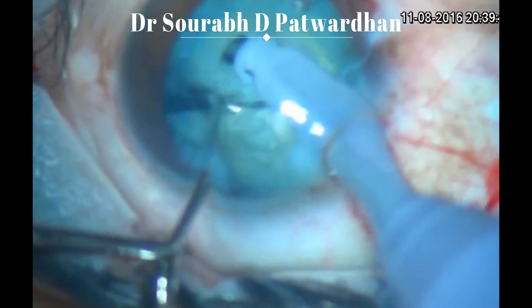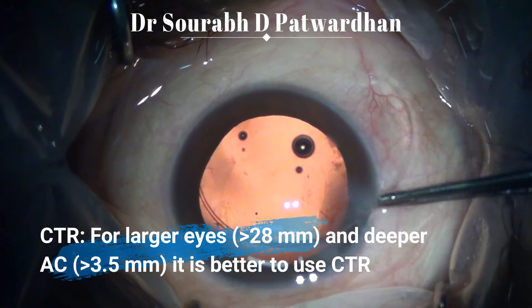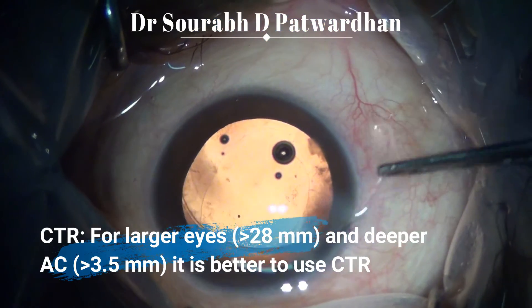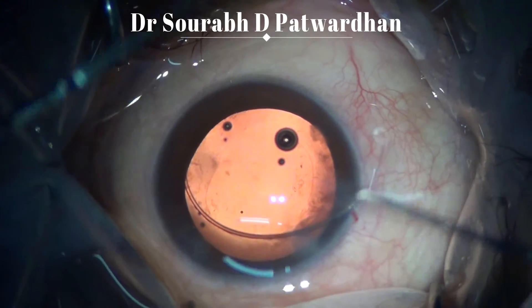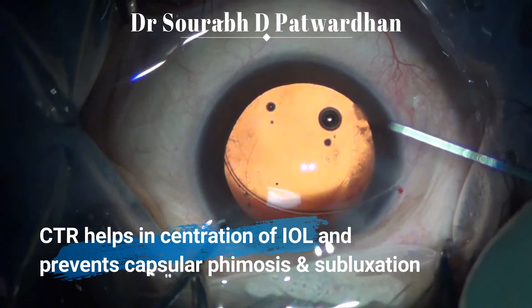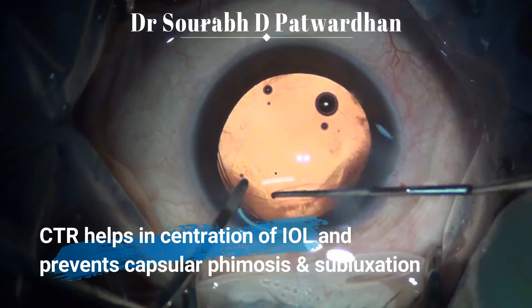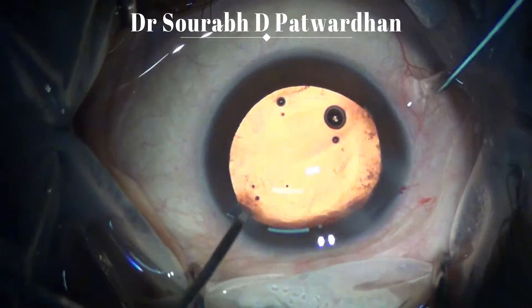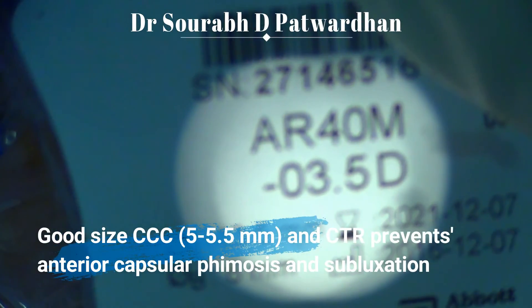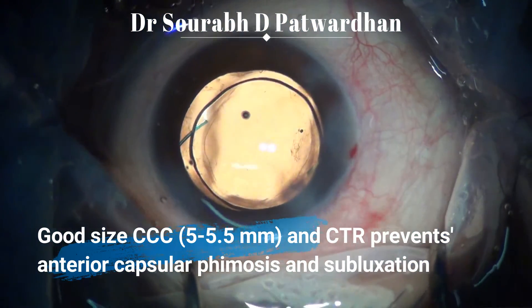I usually prefer to use a CTR (capsular tension ring) for larger eyes and eyes with deeper anterior chambers, because the CTR helps in centration of the IOL and also prevents capsular phimosis. It is important to have a good-size CCC in high myopia cases to prevent anterior capsular phimosis.